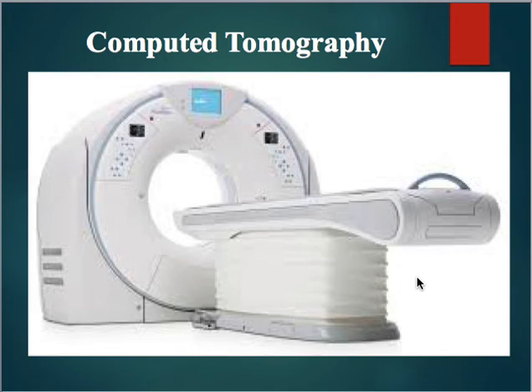So take that loaf of bread and stand it on the end, or what my kids like to call the butt pieces. So you've got a butt on top and a butt on the bottom, and all the slices of bread are in between. When we talk about how CT scans, the amazing thing is the machine is taking those slices of an image, and it depends on the machine, but they're about 0.5 millimeters to 1.5 millimeter slices.